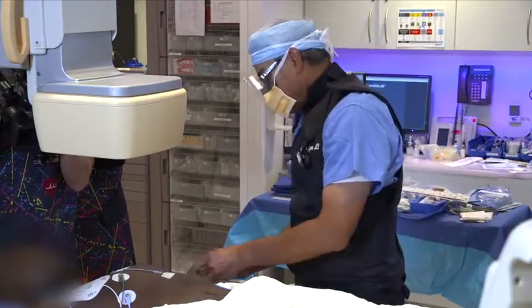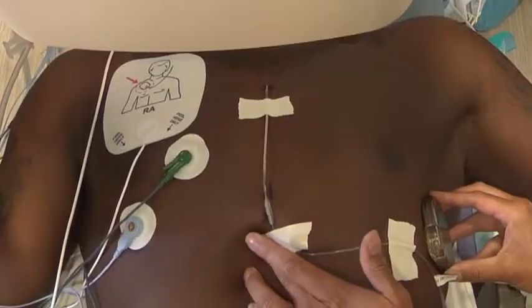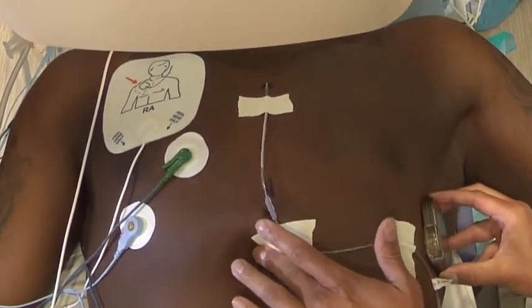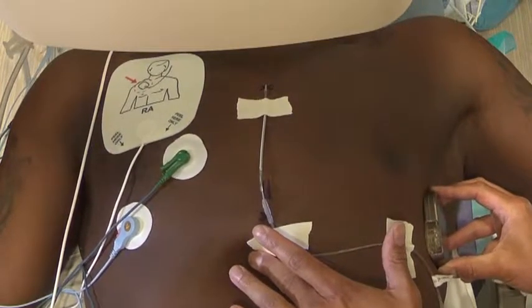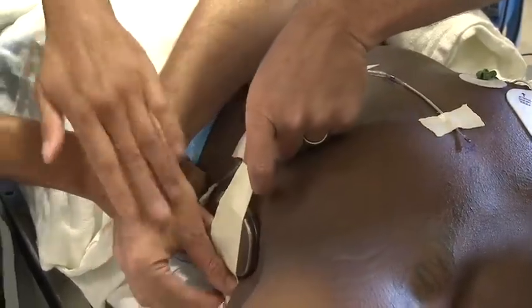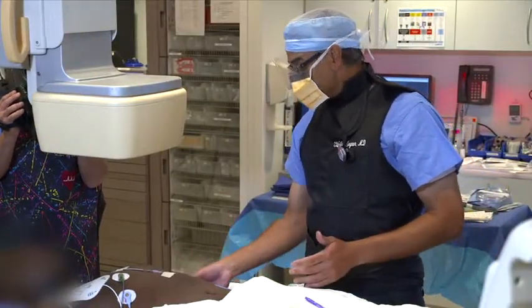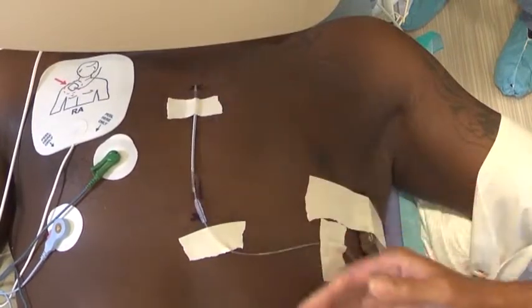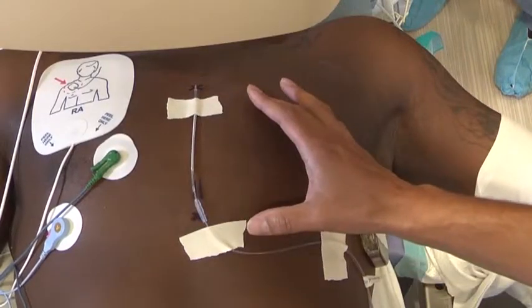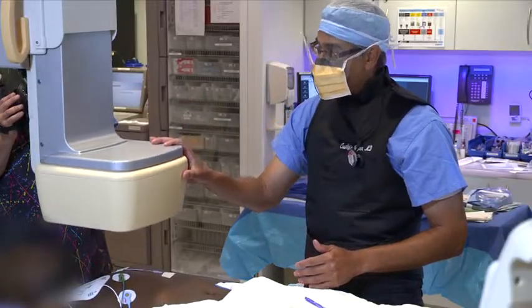The electrode looks good; now it's time to look at the can. We'll use tape on that too. Here's your sternal notch, here's the costal margin, the lead coming straight over approximating where the xiphoid is. We can make little manipulations to the can to see if it's where we want it. In terms of the position of the generator, you want to envelop the heart — you want the mass of the left ventricle between the can and the electrode. The vector may follow the columns of blood in the chambers between the valves. We'll take an AP image and then a left lateral image.